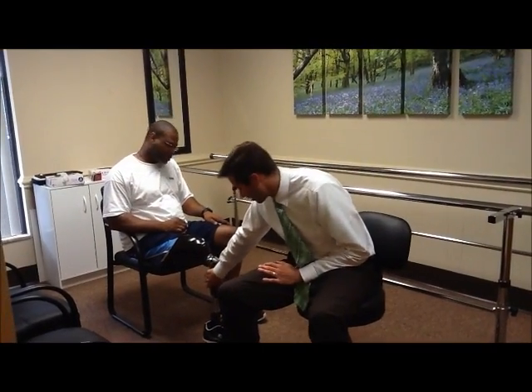It also adjusts to different cadences. So if you're going to walk fast or slow, there's a wide range of gait that the knee can be adjusted to. There are adjustments that your prosthetist can make on the back of the knee that allow you to dial it in for each person's unique needs. It's one of the best knees out there today, and Robert is going to demonstrate just a little bit of those features now. We'll show you a few clips illustrating those particular features.